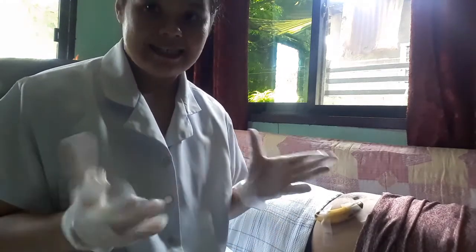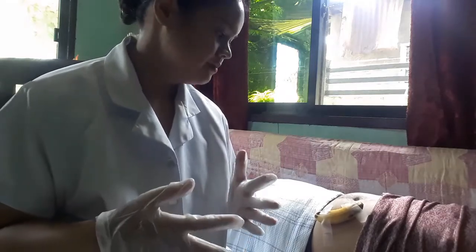After disinfecting the area, we will let it dry, but we will not blow on it. We just let it air dry. So now we will get our syringe. We will remove the cap of the syringe and put it on the medicine tray, and using our forefinger and thumb, we will hold our syringe. It's just like we are holding or playing a dart. And insert it quickly at a 45 to 90 degree angle at the patient.